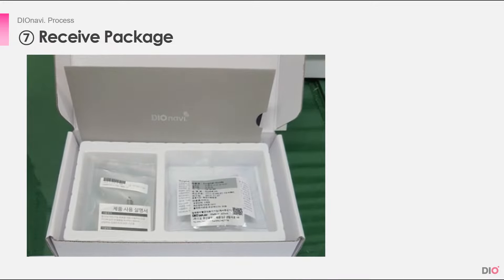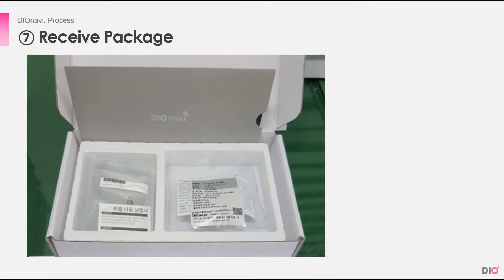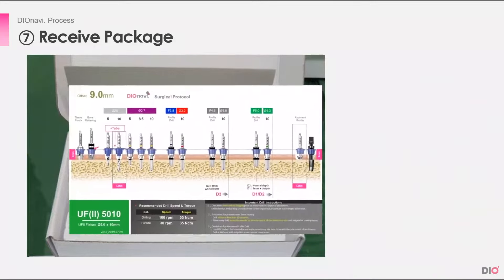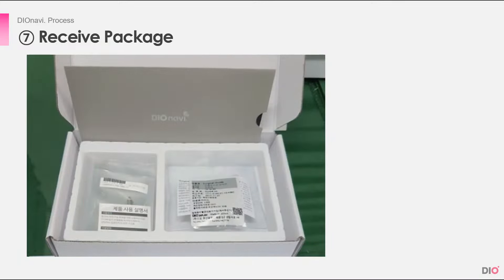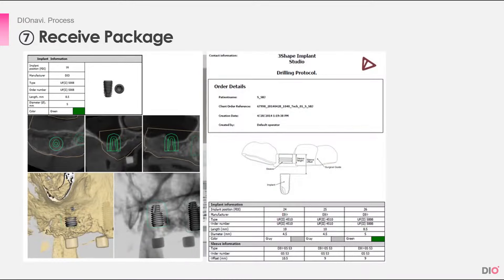In the delivery box, depending on what was ordered on the DioNavi website, all the manufactured products such as stock abutments, customized and digital abutments, temporary crown, and abutment jigs will be sent, along with the surgical guide and a surgery protocol. Sometimes the surgery report and drilling protocol are also included in the box. If they are not, they can be downloaded from the DioNavi website.